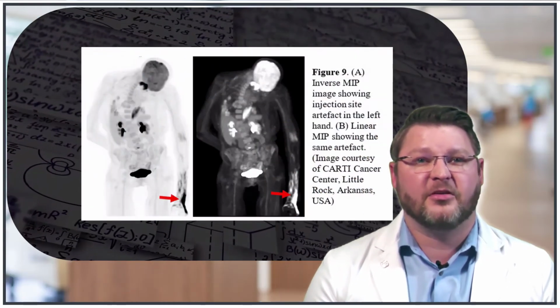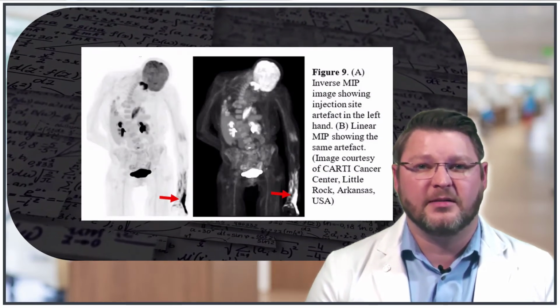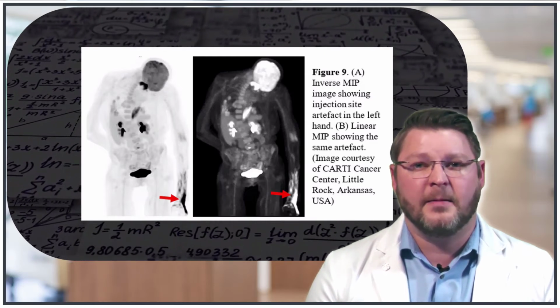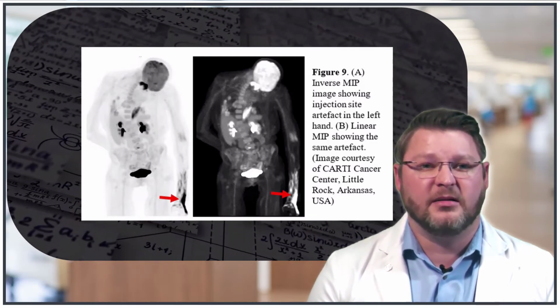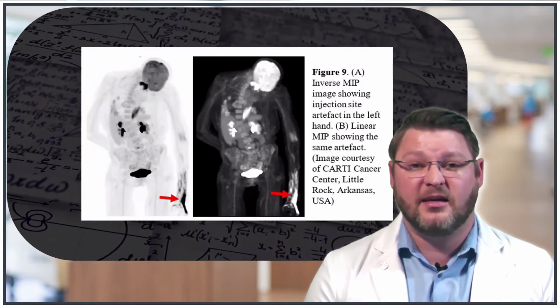Injection site artifact. Vascular access is a particularly important step to secure prior to injection. In some cases, proper vascular access is not obtained, and a portion of the injection is infiltrated. In most cases, this is not severe enough to repeat the exam, but it can range in severity, resulting in a non-diagnostic to a diagnostic exam.